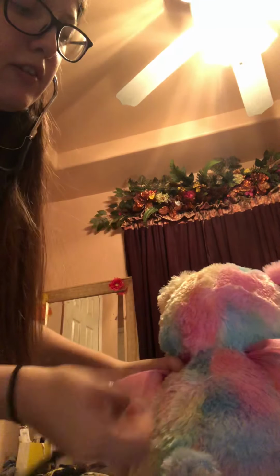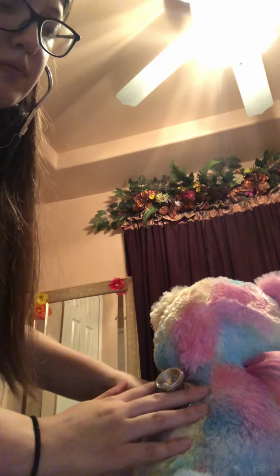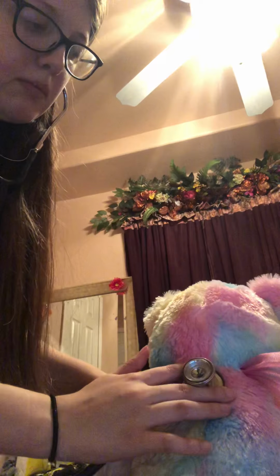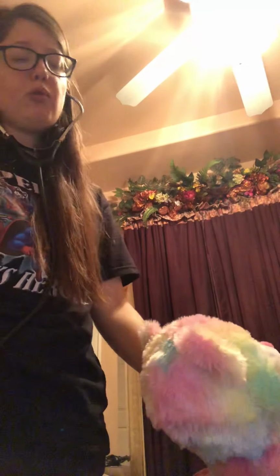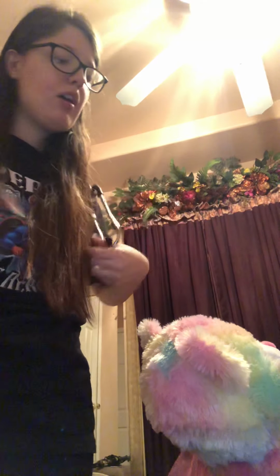And I would start listening for any abnormality sounds. I would go all the way to the 12 points in the back if they are abnormal, and if they are not, just a few. I would just do just a few.